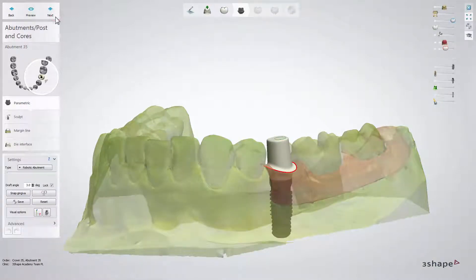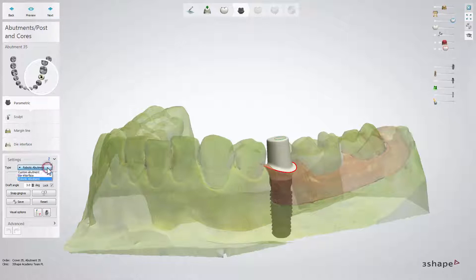Now, being in the step called Abutment and sub-step Parametric, start designing your abutment. We recommend to work on a robotic abutment. The type of abutment can be changed under Settings.